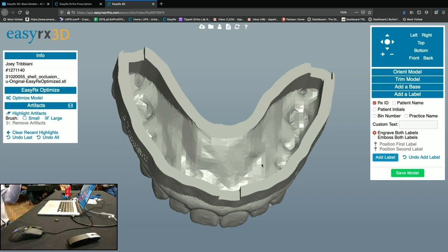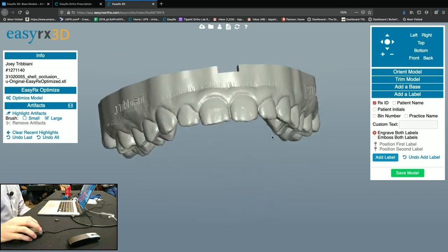So you'll print this layer, and another layer, and another layer, and there's no support, that layer will just fall off into the resin and then stick to the side of another one. It's a big mess.